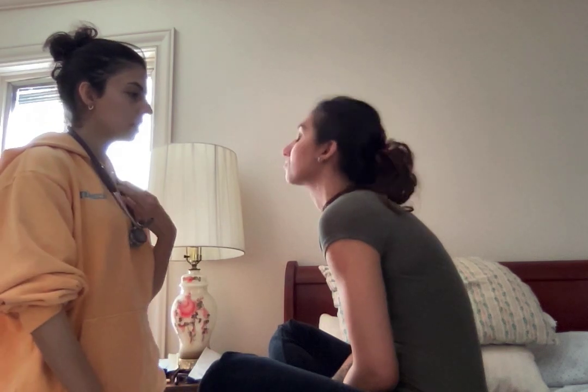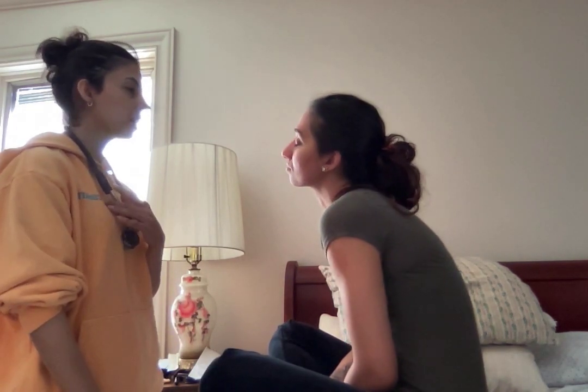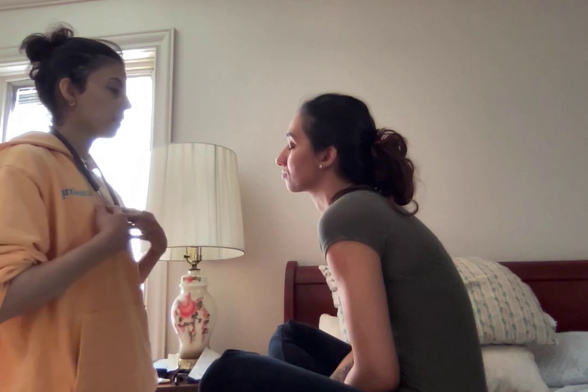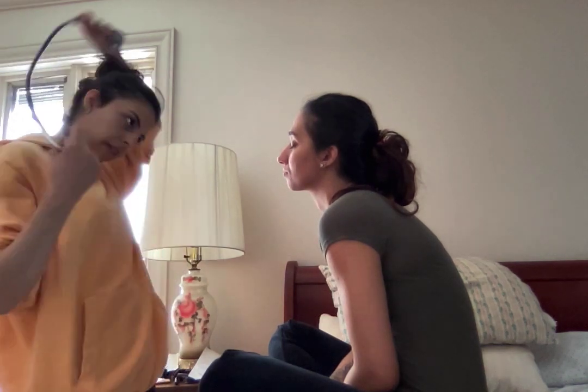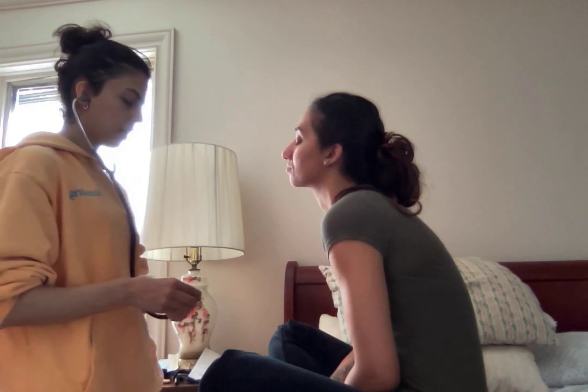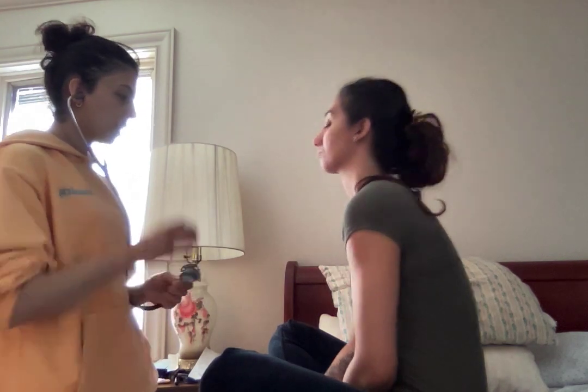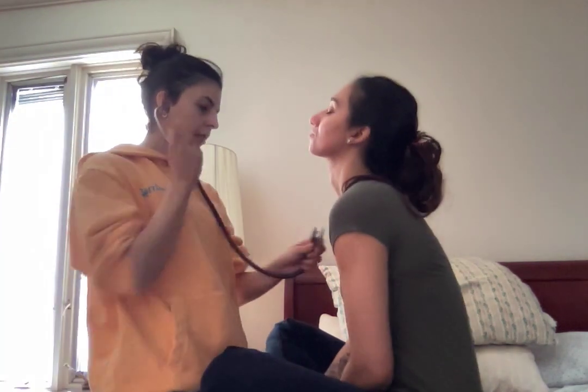First is the aortic on the right side, second intercostal space; pulmonic on the left side, second intercostal space; tricuspid on the left side, fourth intercostal space; mitral on the left, fifth intercostal space. I'm listening for S1, S2, and any murmurs. I'm going to start by using my diaphragm, then we'll repeat it using the bell.